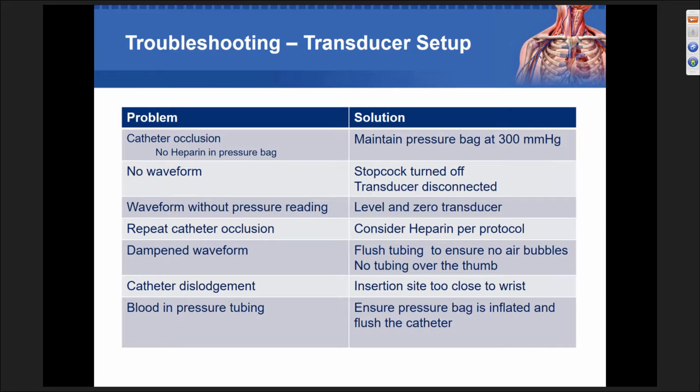Another option really is, where's the position of the catheter? And again, I'm going to keep saying that. I'm probably going to sound like a broken record, but position of the catheter is so, so important, and we're going to go through that when we look at insertion site selection.